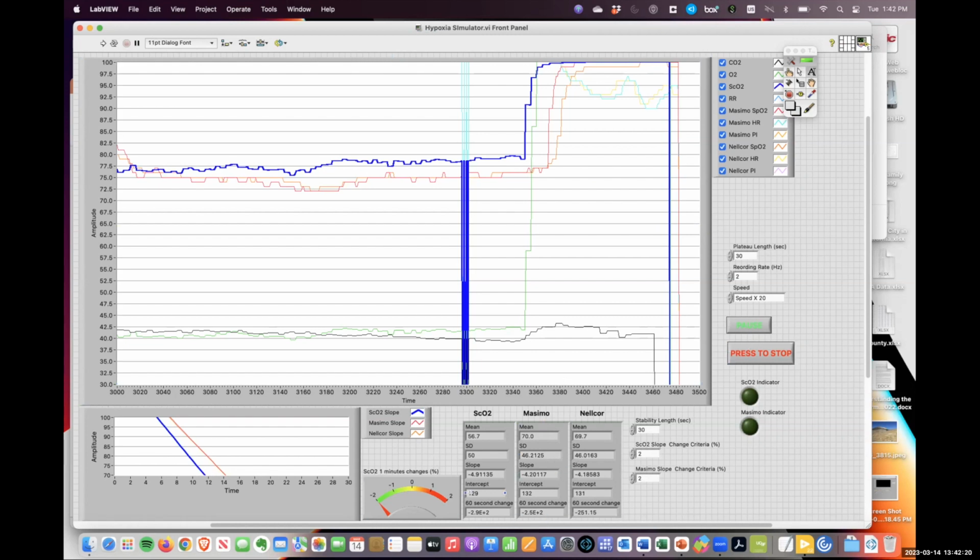I'm trying to come up with some intuitive displays so the corner of your eye can help people. It takes a while to perfect this algorithm, but I can do this offline. We can do this to evaluate quickly how good a run it is. And ultimately, we would like to reject bad data based on objective criteria and not bring in bias just because it doesn't look good and it doesn't match the blood gas data.